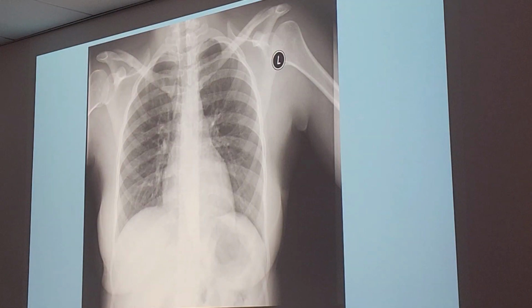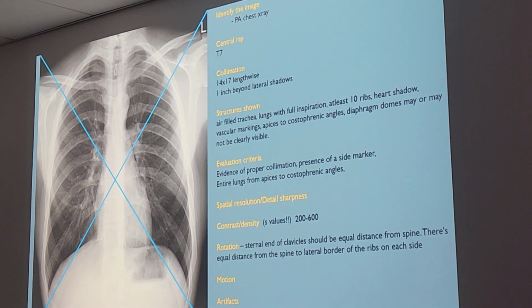I have a question. For the previous image, if I count, I think it counts to like T7 or T8 or 9 where the centering is. Would that be one mistake? Yeah, that would be one mistake. And if your marker didn't have your initials, that would be another mistake. But we don't use the image without a marker, right? Correct, I'm just saying. In real life. Okay.